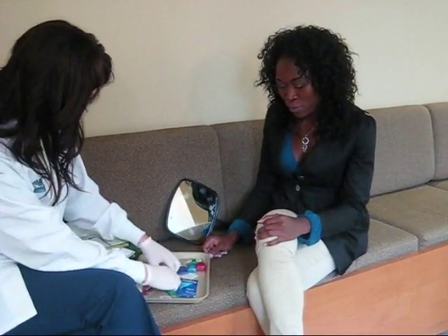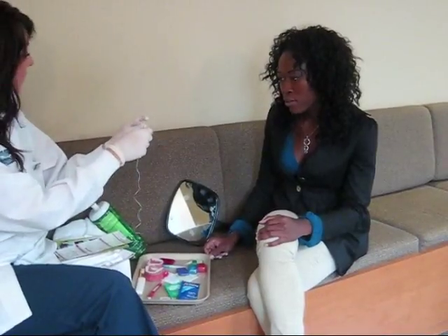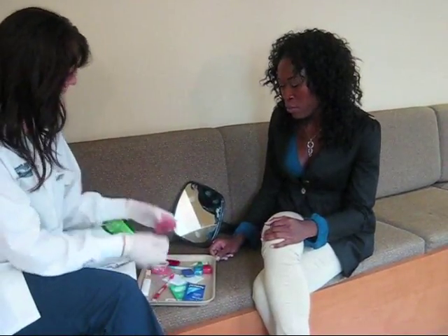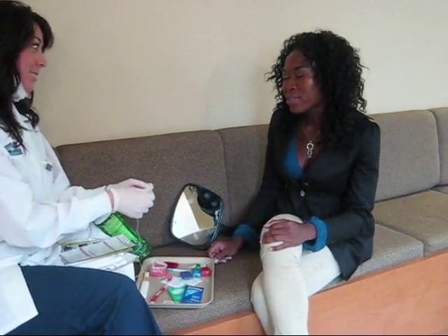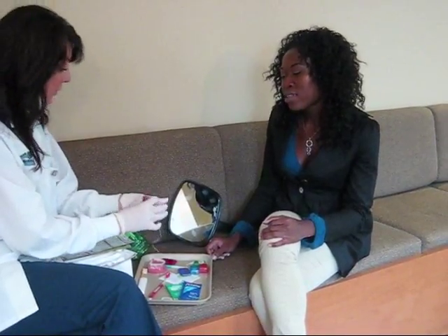Next, you want to make sure that you're flossing. For flossing, we have these floss threaders for you. You just tie your floss onto the threader. This is going to allow you to get underneath the wire. Flossing as you normally do.